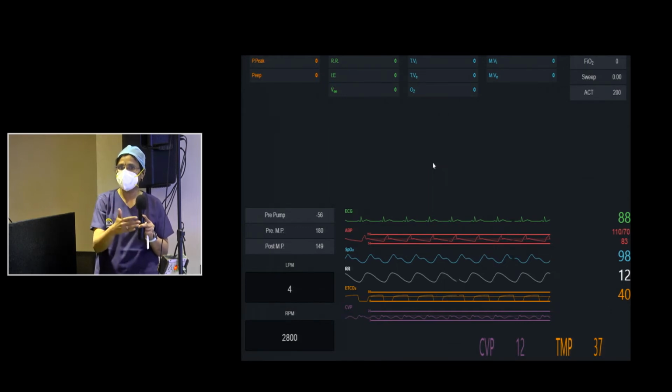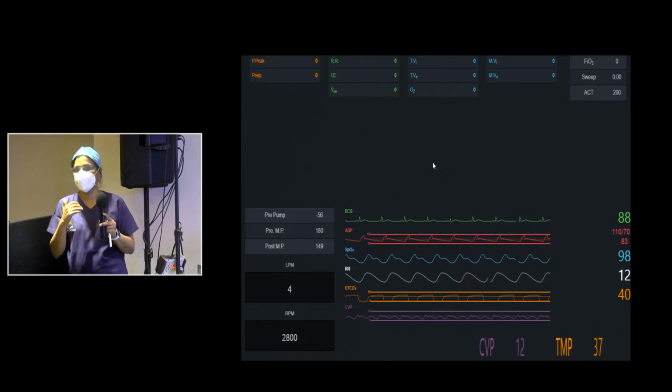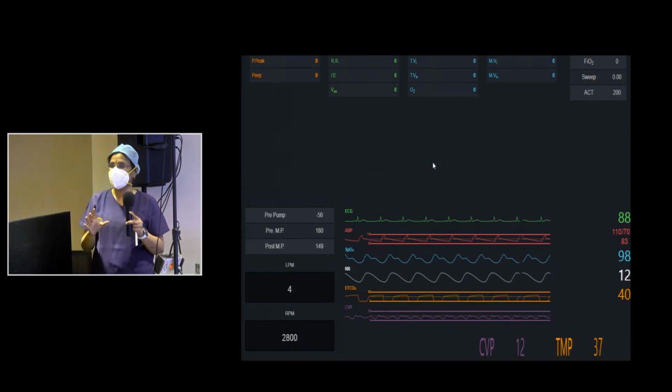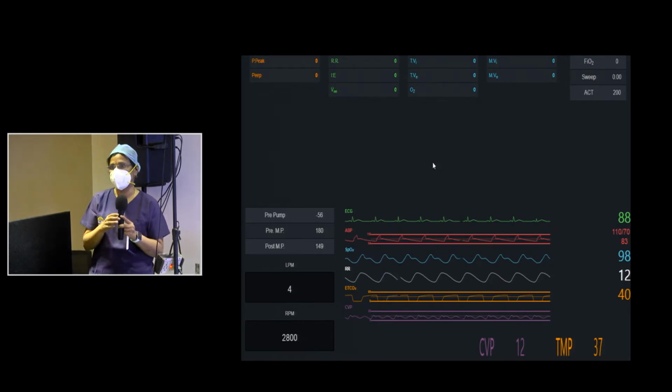This is easy for us because all these patients, especially with COVID, we are going to keep on ECMO for more than a month. Your initial suture is not going to hold for more than 10 days, however well we secure the sutures. We initially thought putting a purse string was very good, but the purse string itself causes skin necrosis and causes further migration. So identifying at what level we place it is a quick guide, with the aid of your imaging.